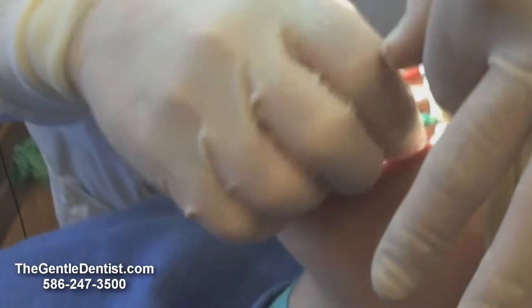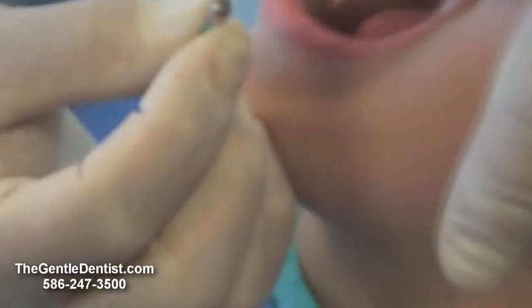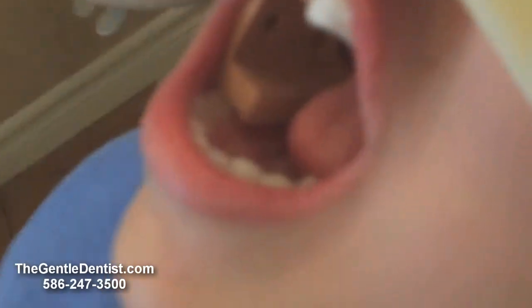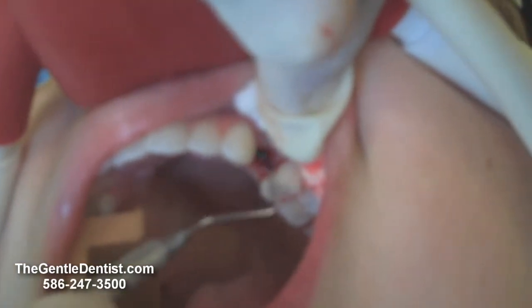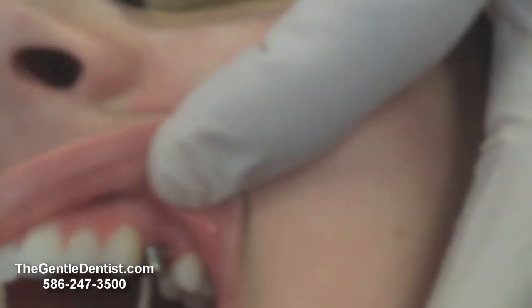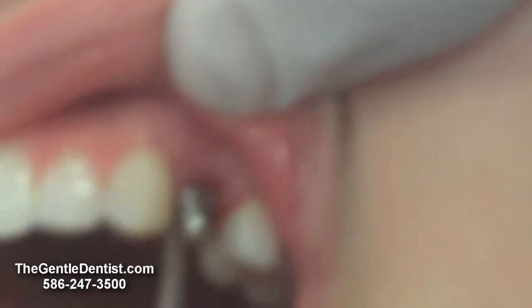She's going to spend maybe a couple days with a little discomfort or a little pressure, but that should be about it, believe it or not. Like I said before, most of the pain comes from the fibers around the bone. This is the implant abutment, which will be modified so that we can give the most aesthetic result possible. The abutment is a metal piece that is torqued into the implant, which is the screw that goes in there. That will support an aesthetic crown. We're going to make a temporary right now, and we'll finish that up in about 4 weeks or so, and we'll let you know what it looks like then.